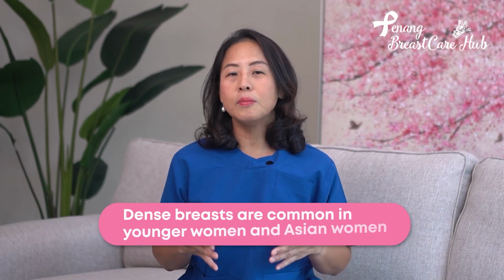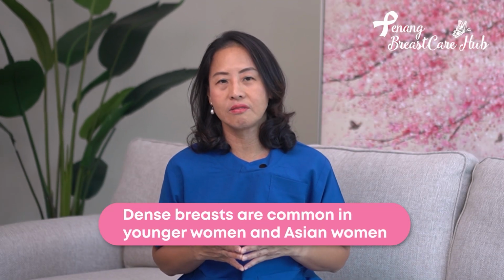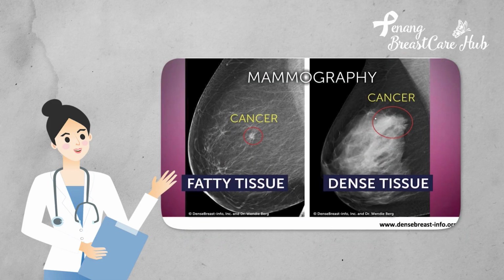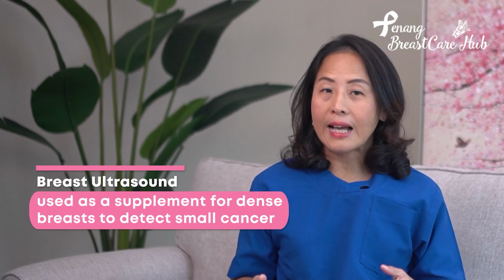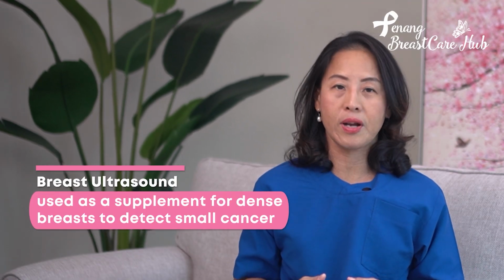Younger women and women of Asian ethnicity are known to have dense breasts. Breast density is due to the breast having more fibrous or glandular tissue and less fatty tissue, and it is more difficult to detect cancers in dense breasts on mammogram. Therefore, breast ultrasound can be used as a supplement for dense breasts to detect small cancers that may be missed on a mammogram.